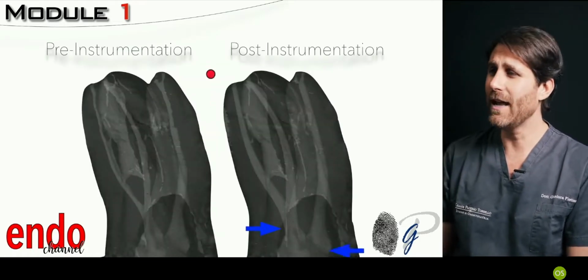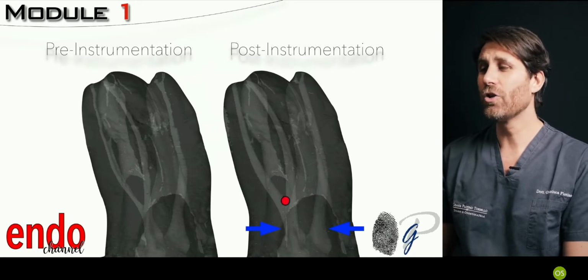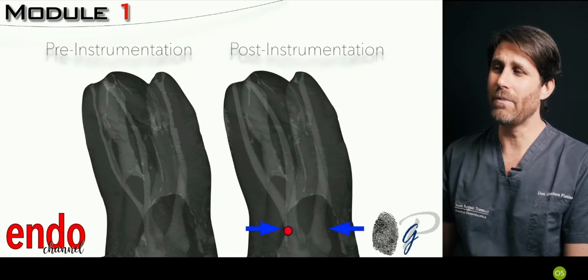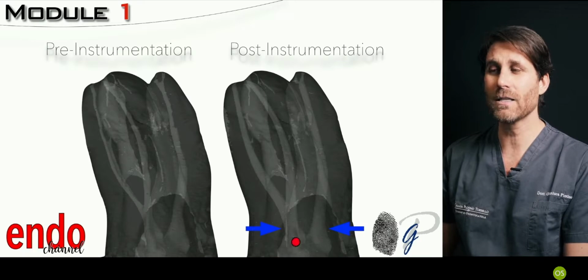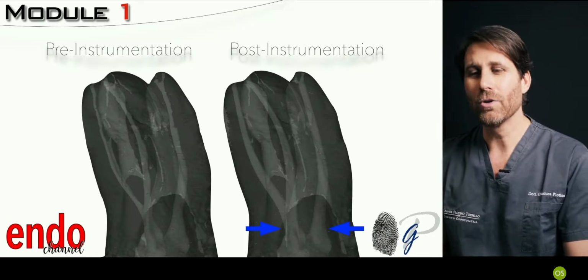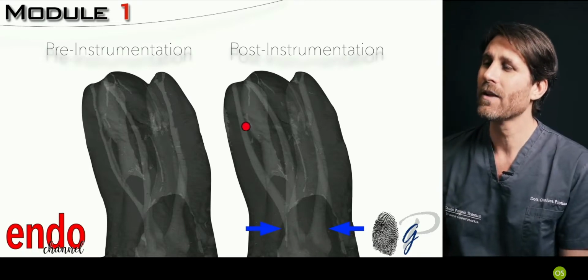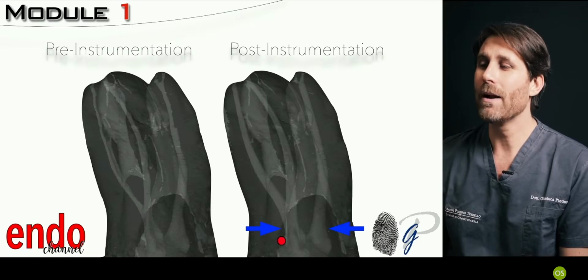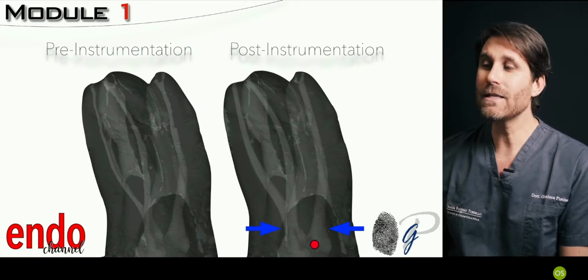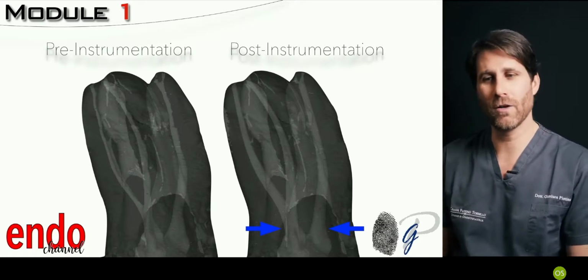This pericervical dentin is very important for the resistance of the tooth. The arrows show the post-operative, post-instrumentation of this upper molar, with the maintenance of as much dentin in this area since the beginning. We have the possibility through our instruments to insert the instrument not anymore perpendicular to the occlusal surface, but with an orifice-directed orientation. This will give us the possibility to save dentin in the coronal structure.